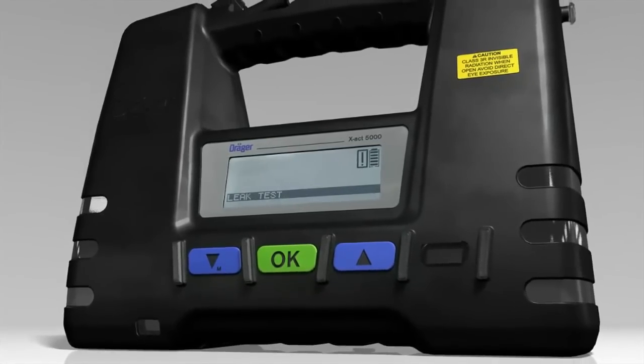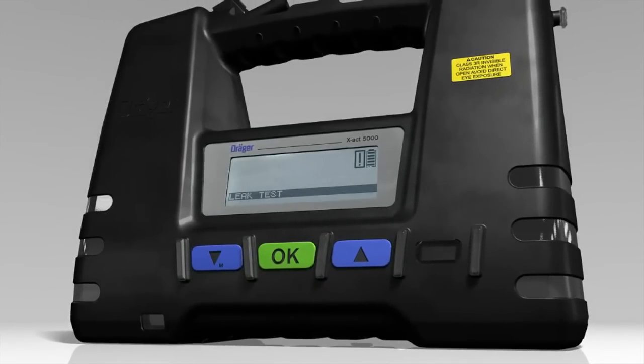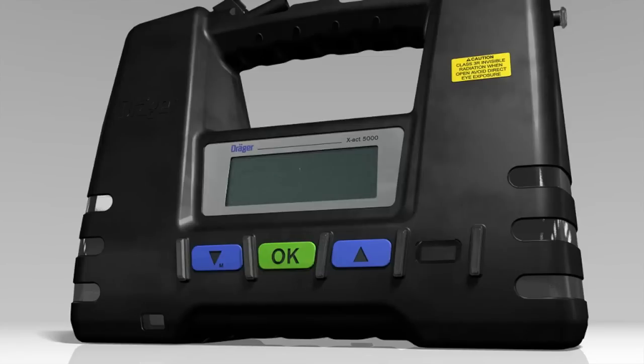To switch off the tube pump, press the up and down buttons simultaneously. The tube pump will now count down from 3 to 1. Afterwards, an automatic flushing cycle will start to remove any residual reaction gases. This will take about 5 to 10 seconds. The tube pump will then power down.